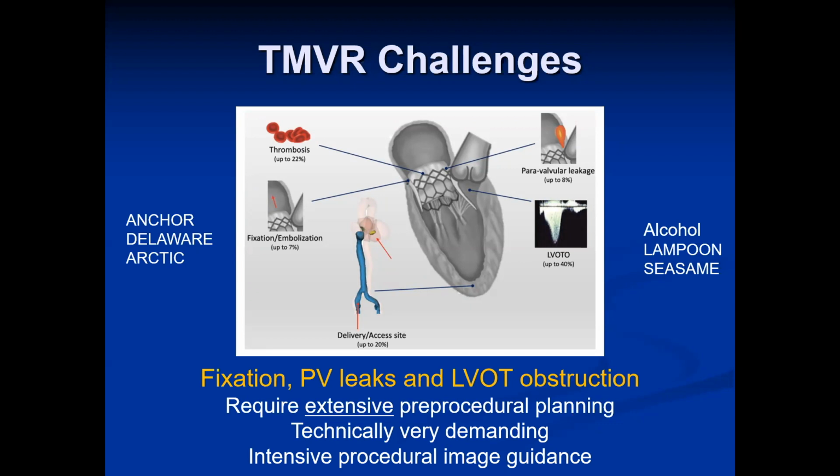Sort of discouraged by the fact that if you place a clip, it causes problems for you with the later surgical procedure. I'm interested in how often, if ever, you see a patient that's considered too sick for surgery, gets the clip, and improves to the point that they're now surgical patients. Is that even on the table in light of what you said about clips negating the benefits?